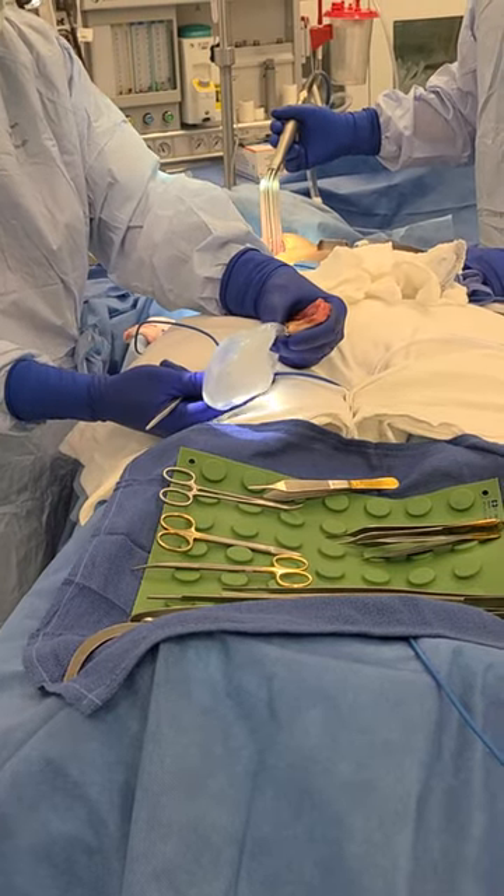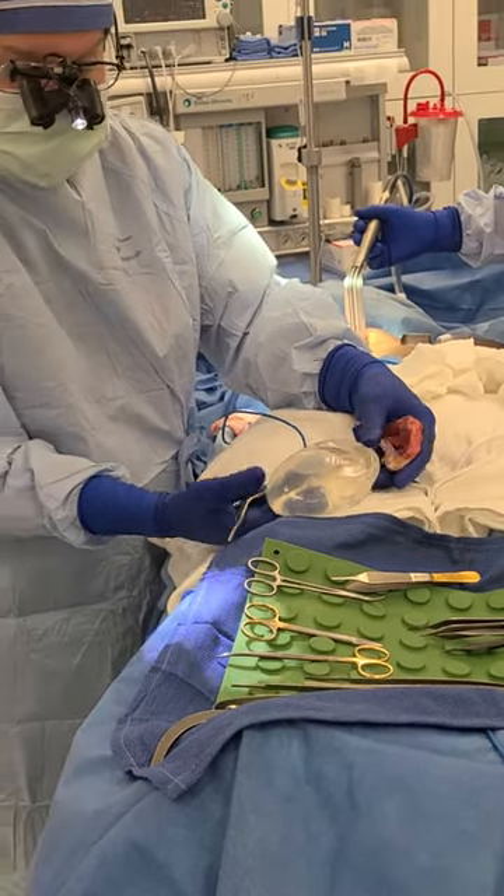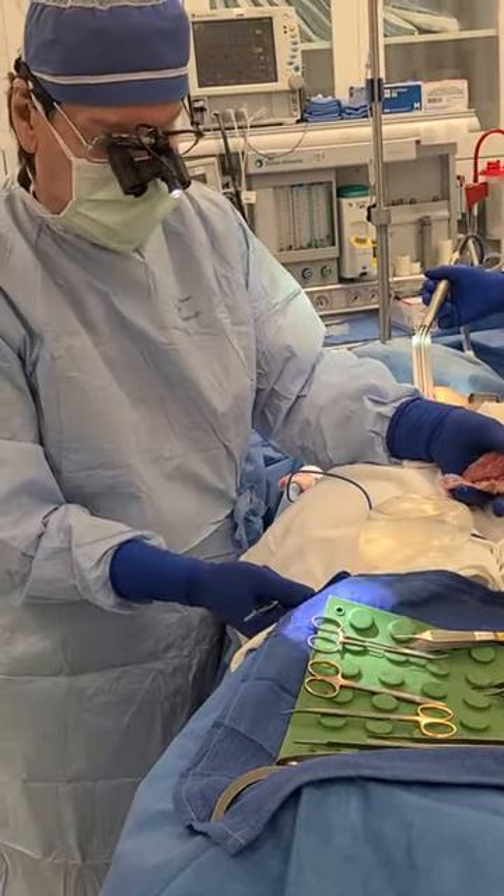This is an Allergan Style 15, 286cc smooth wall silicone implant.